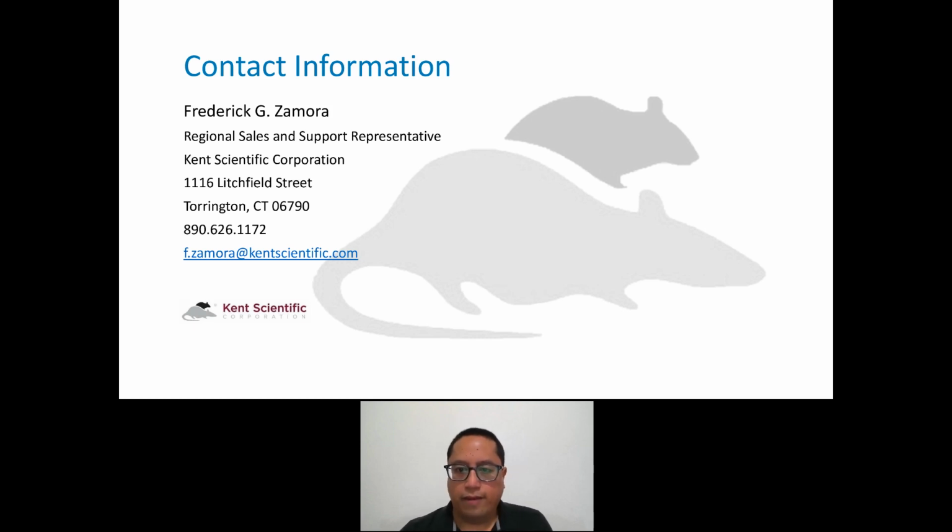We've got another question here from Jackie. Can you use the SomnoFlow and Somno Suite with an automatic scavenging system, or just with a canister? Excellent question, Jackie. Because both our SomnoFlow and Somno Suite are passive, we do not recommend using an automatic scavenging system. With our systems, we just supply the canister that you connect, and through passive pushing, it will filter through the carbon filter.